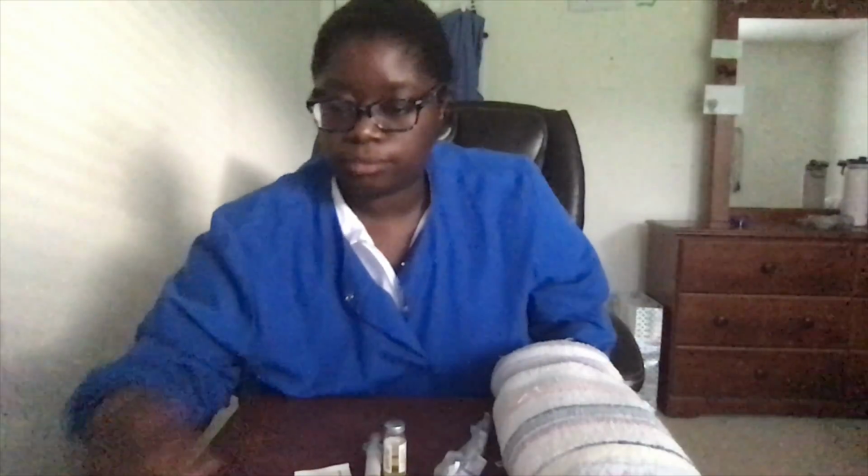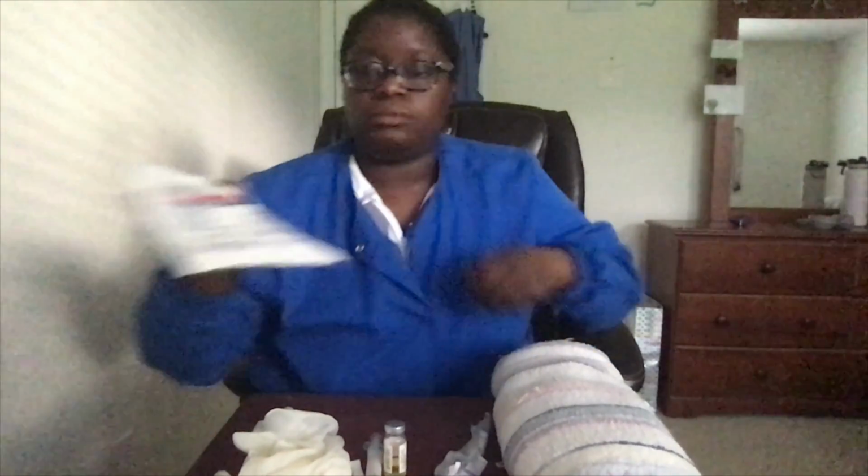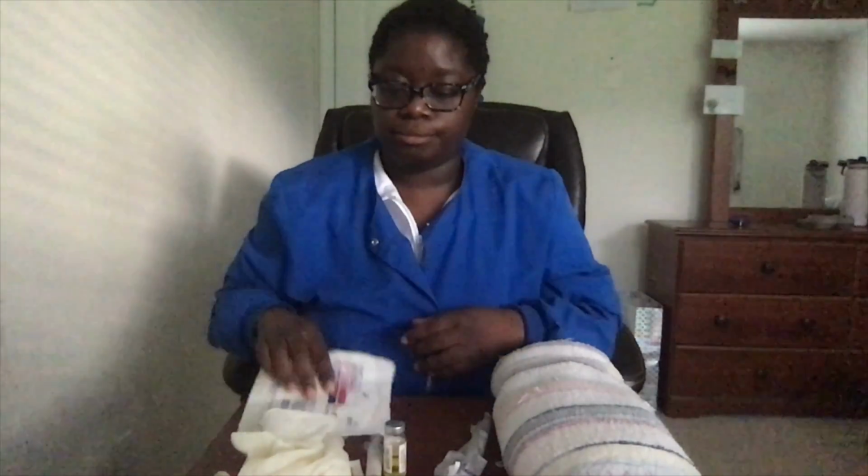The other materials that I'm going to need for this injection are another alcohol pad, gloves, gauze, and a bandage, which is optional. Now that I have all my materials before me, I can go ahead and enter Anna's room.